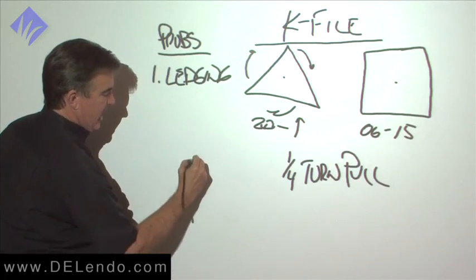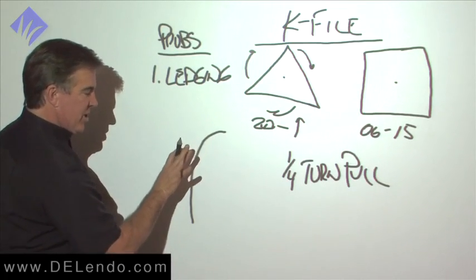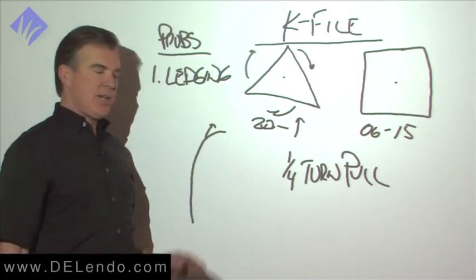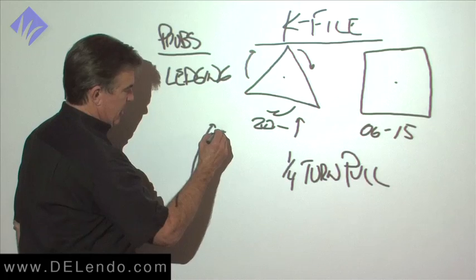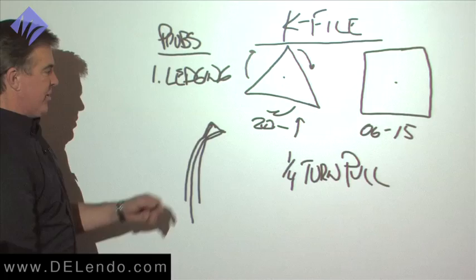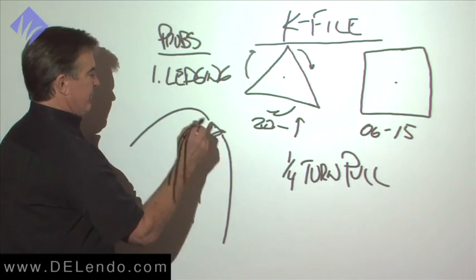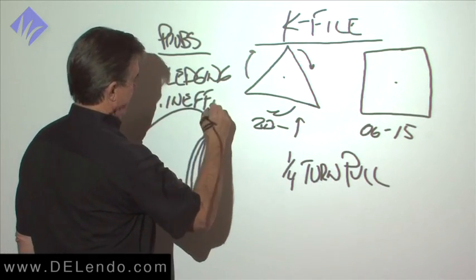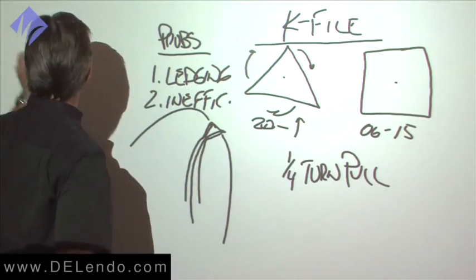Turns out when you have a canal that curves apically, as they do, when we rotate a file in a clockwise direction, the blade is pulling itself upward and it will want to head in this vector. It's not going to naturally go around the curve. And that's how we get this hourglass preparation in our final shape. Okay? That's what we don't want to have. That's one issue. The second issue is it's terribly inefficient. Okay? So it's dangerous, but at least it's not very effective.